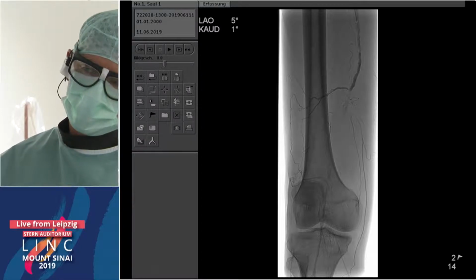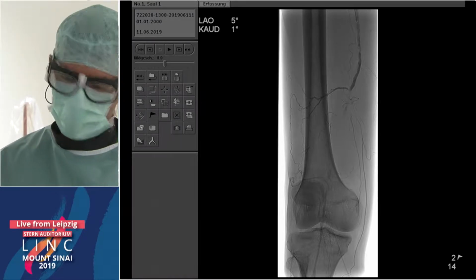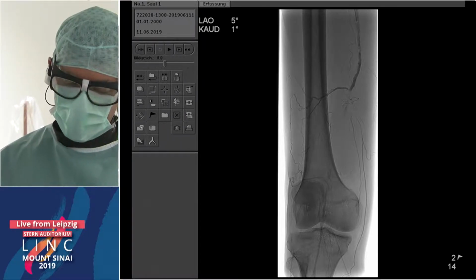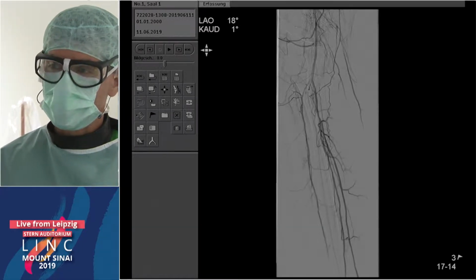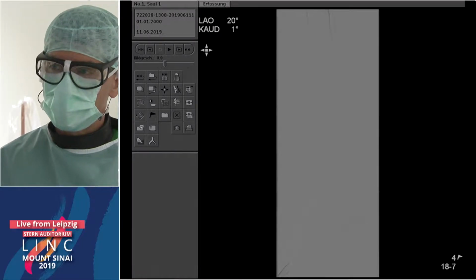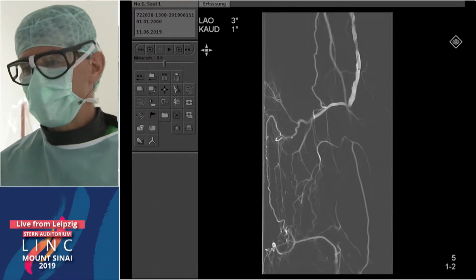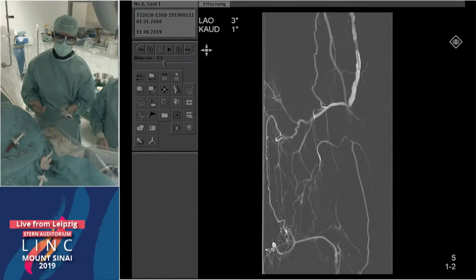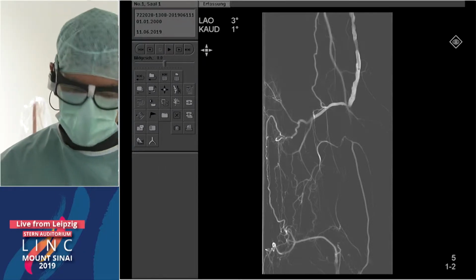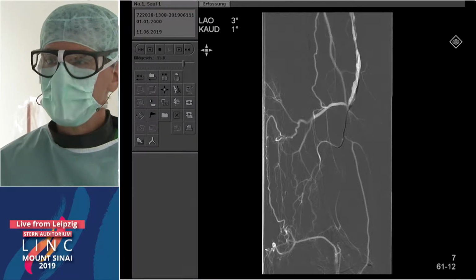Because of this, and also because the arteries are very small, maybe not a good case for direct stenting. So clearly, we'll try here to come along with ballooning with drug-coated balloons. Outflow is okay. He has 3-vessel run down, anterior maybe very small distally, but posterior is very nice here. So we started here to try to get the wire through, and we actually started with an 018 wire with a Command 18, which is somewhat our standard wire here to approach these lesions.